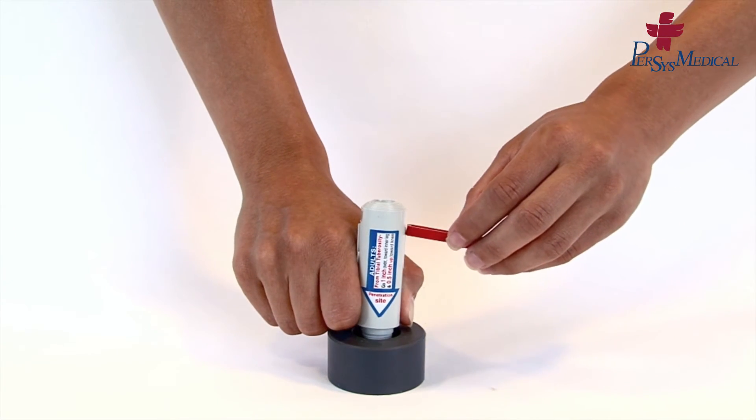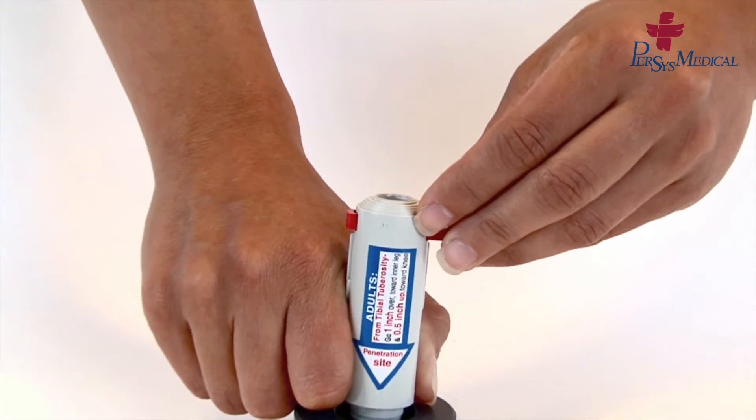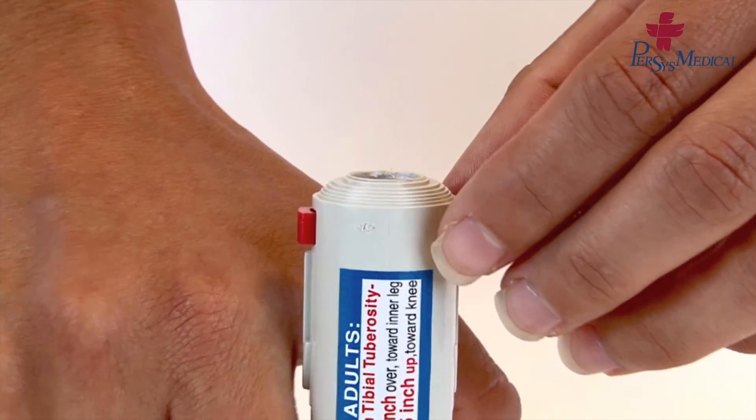Insert the safety latch, placing it through the larger opening first. Make sure the safety latch is firmly in place.